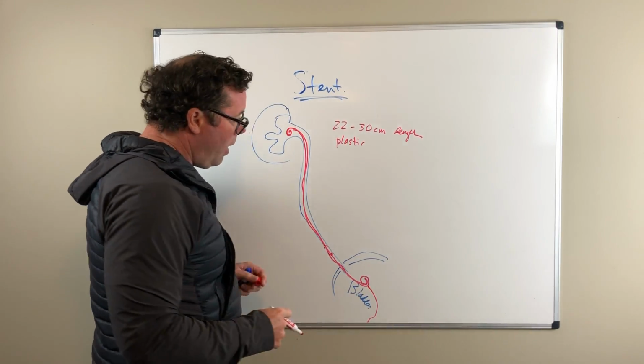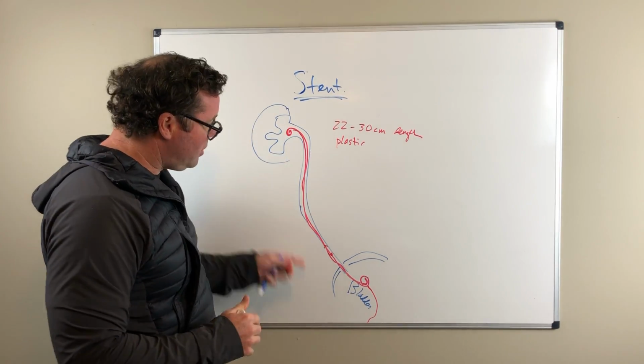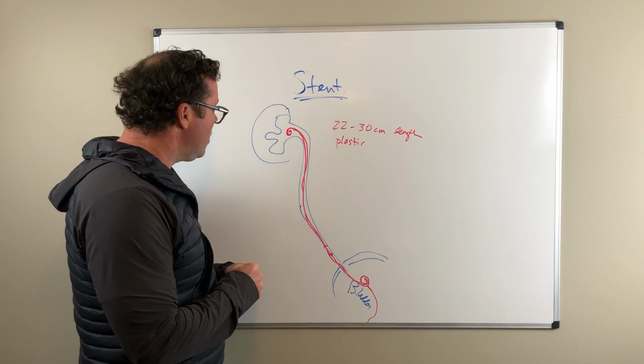So obviously you don't want to remove that stent unless you talk to your doctor. The person that put this stent in, you don't want to remove it until you talk to that urologist.